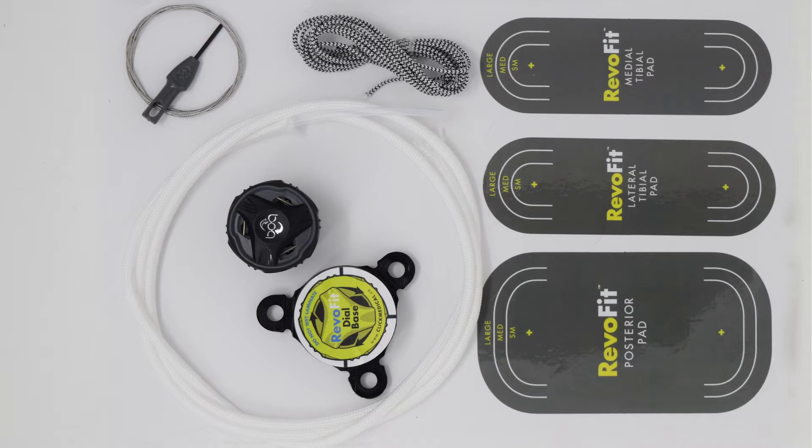In the kit you'll find instructions, a dial base, a dial, lacing, the tubing that houses the lace, a wire lace feeder, and adhesive patterns for outlining the socket pads.